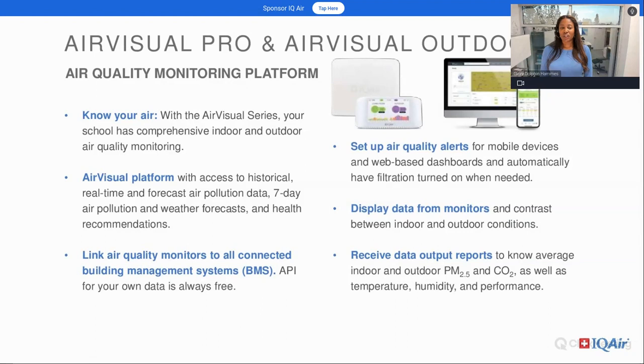You can also take the AirVisual Pro around while you're conducting procedures, making different alterations to your procedure to see which processes will reduce the actual aerosolized particulate matter generation.